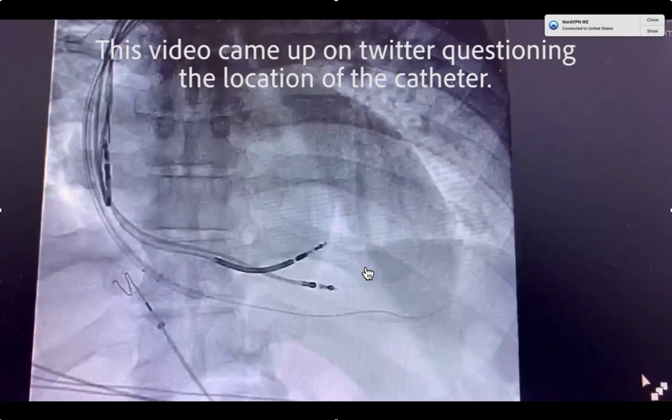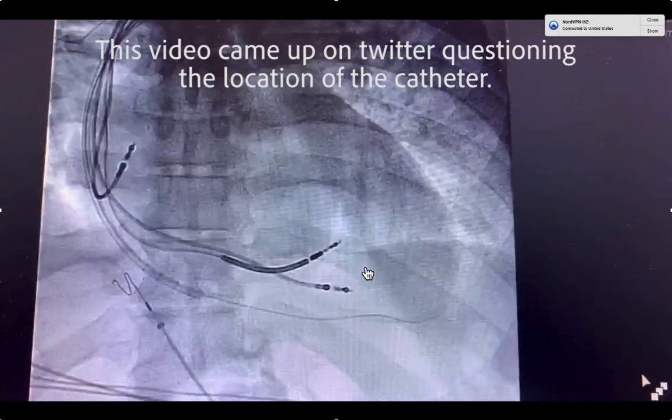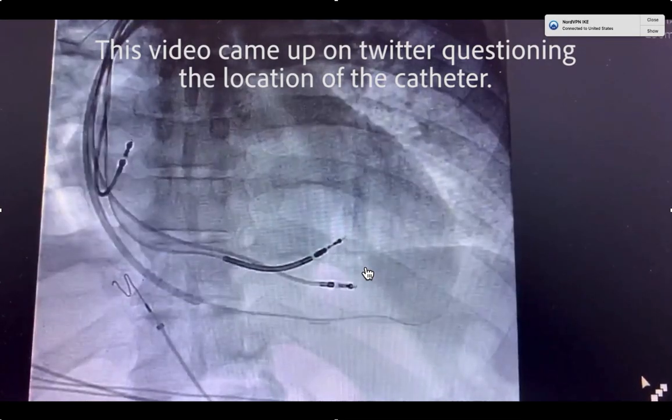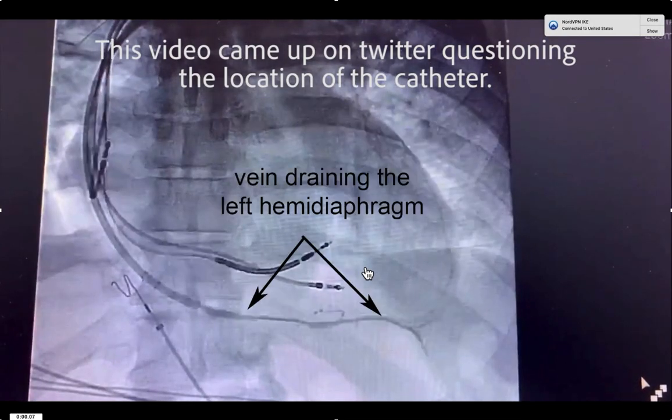On Twitter, there was a question about the location of the catheter. When you inject contrast, you can see that it's actually below the diaphragm, and this is the vein draining the left hemidiaphragm.